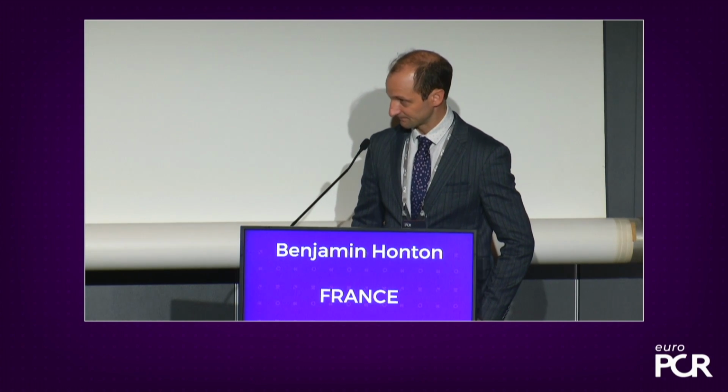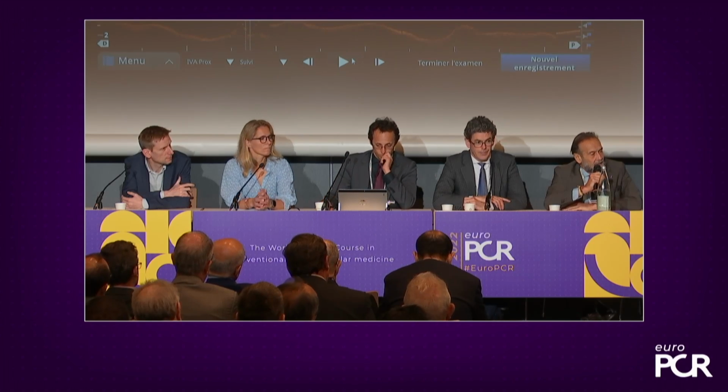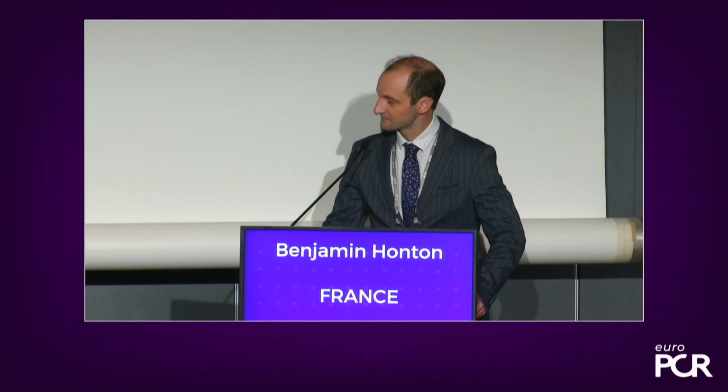I would ask a learning question for the audience and for me too. How do you choose the number of runs to use? Sometimes we see a good result after the first run, but we have other runs to use. You stop if you see a good profile of the balloon. I don't think that you make imaging after every run. It's impossible. How do you choose the number of runs? Sometimes I am in doubt whether to stop, or use all the runs, or 70% of the runs.